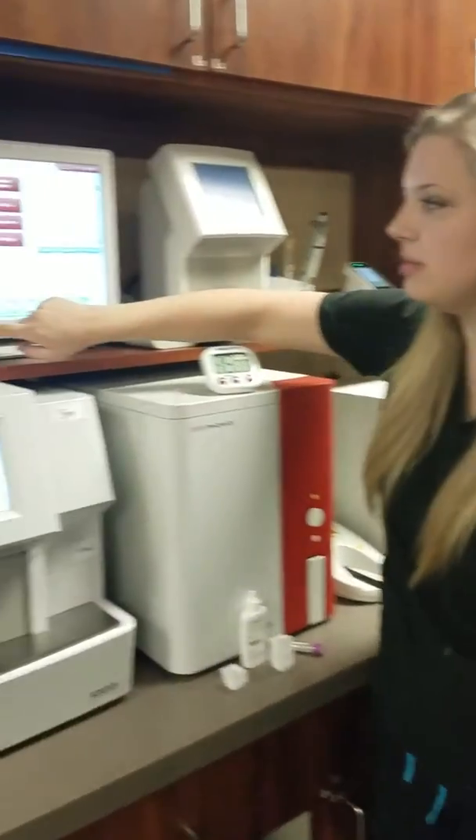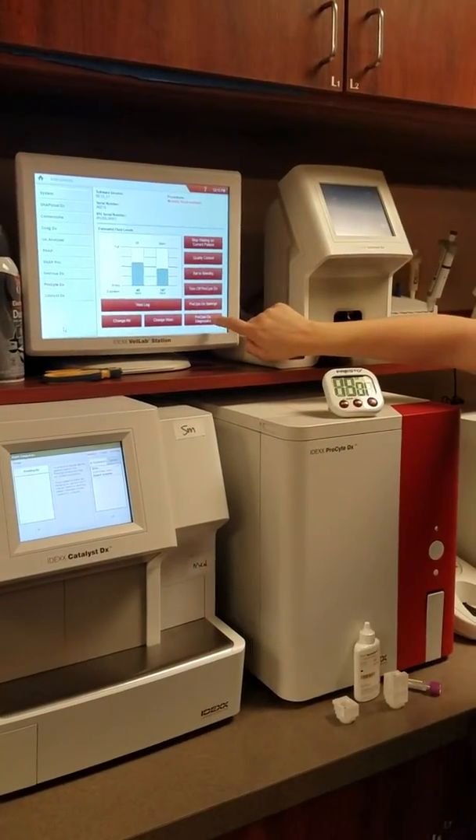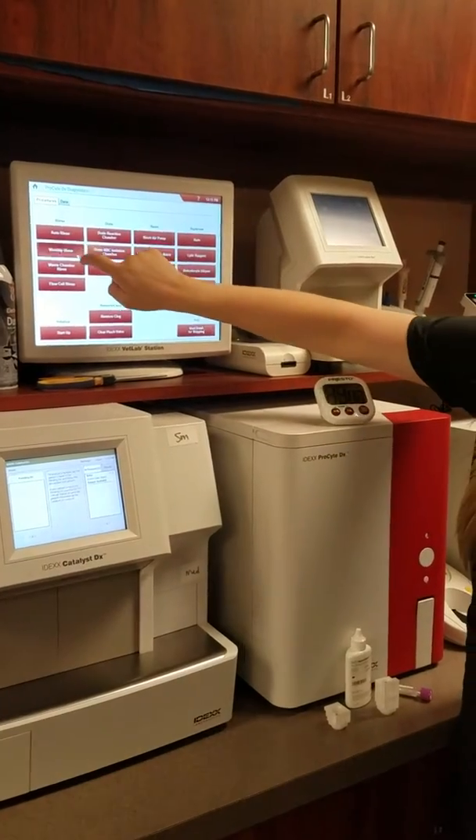So the first step is to come here and press the ProCyte button. You'll go to ProCyte Diagnostics, then Monthly Rinse.